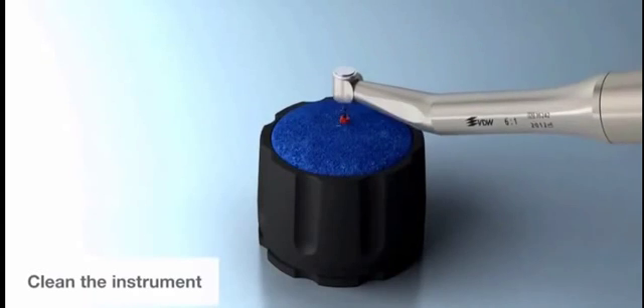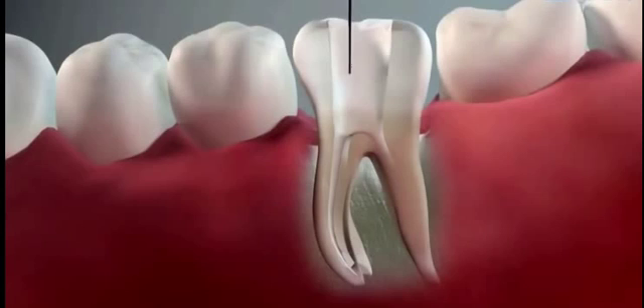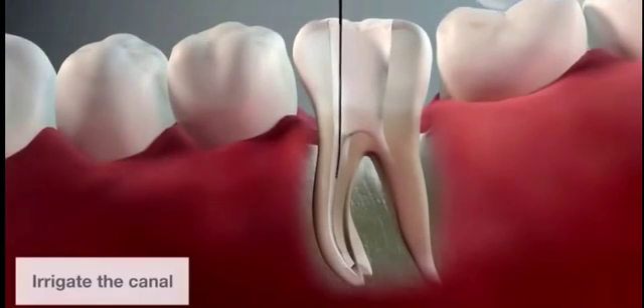After 3 pecks, clean the instrument in the interim stand. Then irrigate the canal.